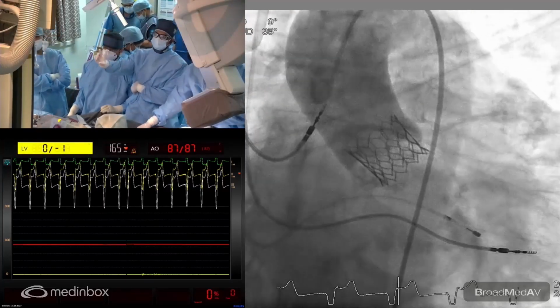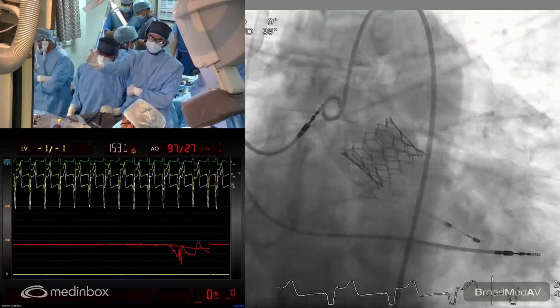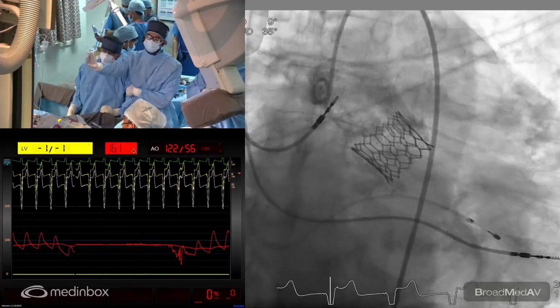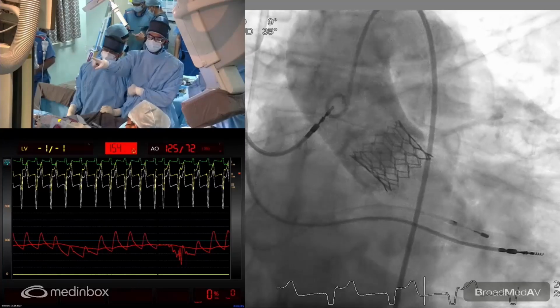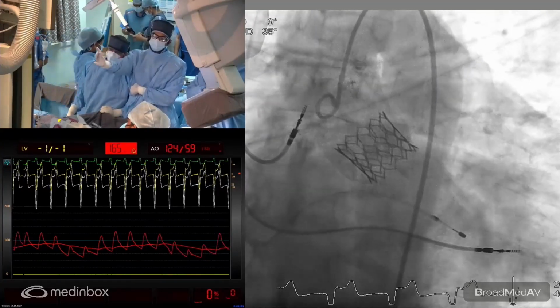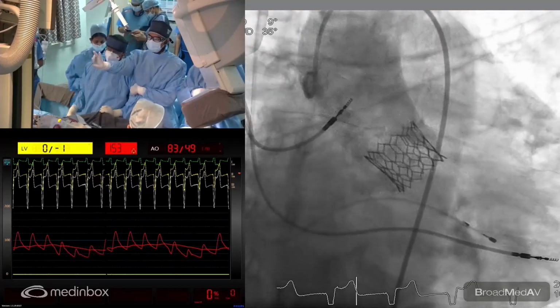Can you just explain it once more before we close? So the commissural posts in Myval are seen as two parallel lines, instead of that, the connected frames are single lines. Only at the commissure are there two parallel lines. So we can see one commissure on the anterior and one commissure on the posterior. If it overlaps both the commissures exactly, it is 0-degree alignment.